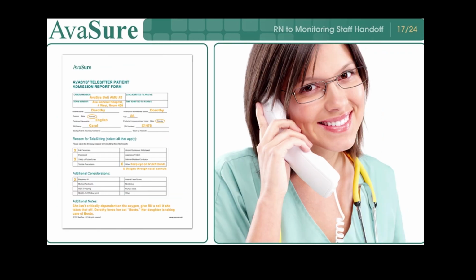This is a sample over-the-phone handoff from an RN. It is important to provide the monitoring staff detailed information about the patient and information about where you are calling from and how to reach you. Let's listen to a sample.